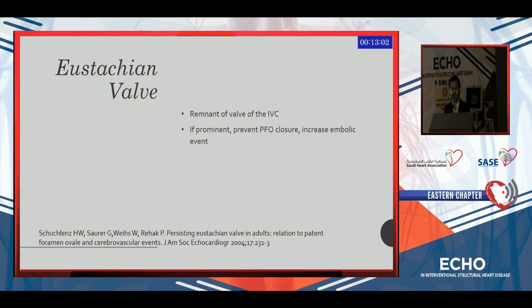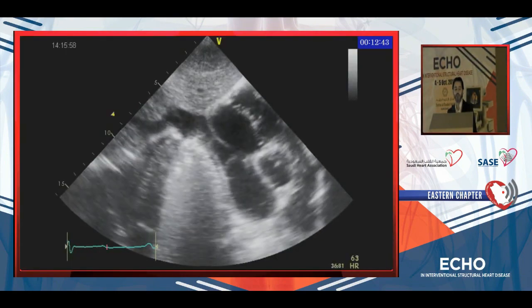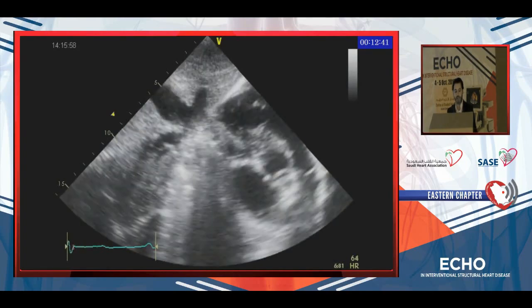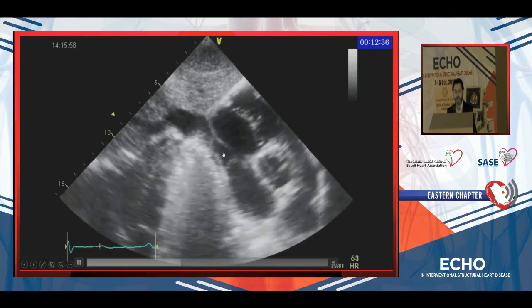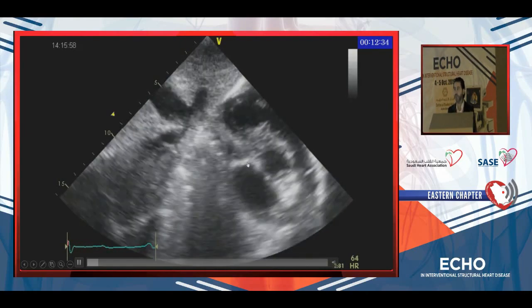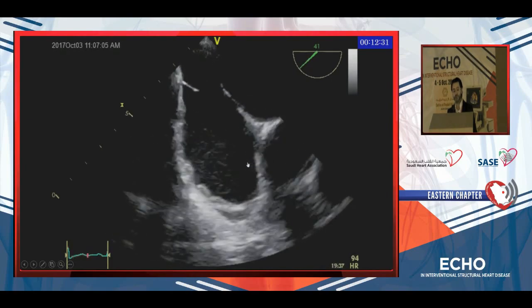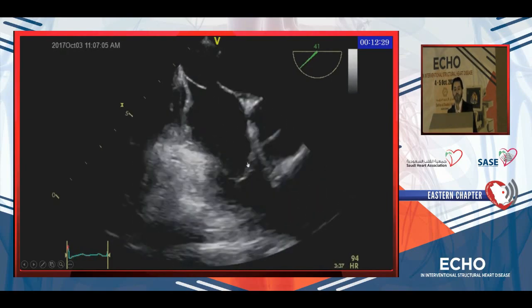What about the Eustachian valve? It's a remnant of the valve of the IVC — it should direct IVC flow directly to the fossa ovalis. If prominent after birth, it will prevent PFO closure and also increase embolic events. This is an example of a prominent Eustachian valve. As you can see, the IVC flow is directed to the fossa ovalis, which will prevent its closure.